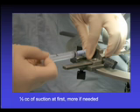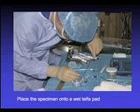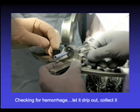Here we take a 5 cc syringe, pull back a half a cc of suction, and then close the opening. The tissue is then removed, placed into a small Petri dish on a wet Telfa pad to maintain moisture of the specimen. If there is any hemorrhage seen from the end of the cannula after the biopsy has been taken, we allow it to drip out and we collect it.